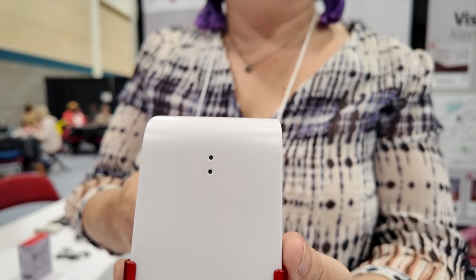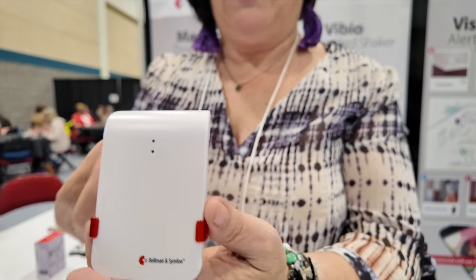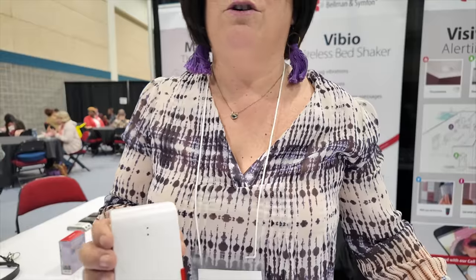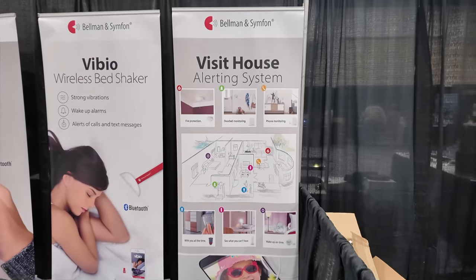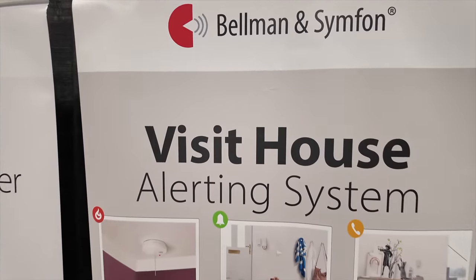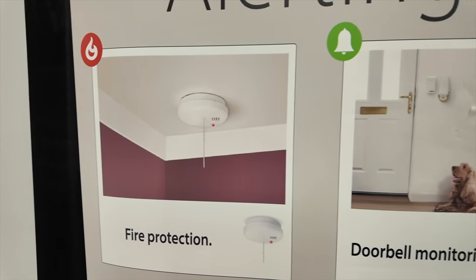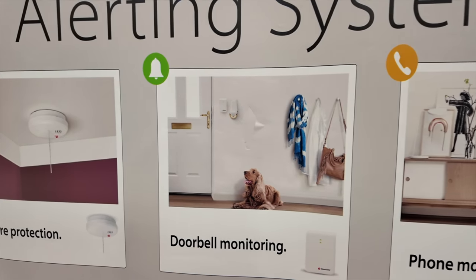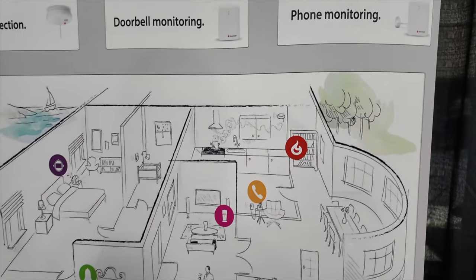Really? And they want to hear their baby, you know, sound or crying. It acts like a baby monitor, but it picks up the sound, and then when it picks up that sound, it sends it to the receivers. So just different ways of increasing the visibility of communication. Yes, it's like depending what you need, fire protection. Oh, I love it. The doorbell, your phone. Anywhere in the house where you can have all of these transmitters and receivers where you feel the most comfortable listening to that sign.